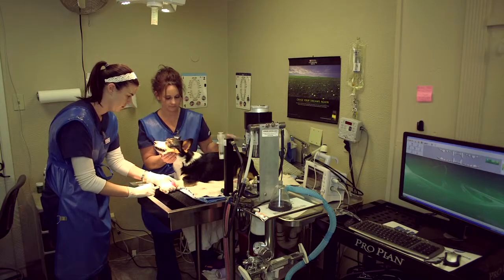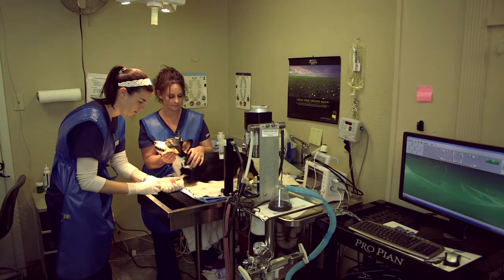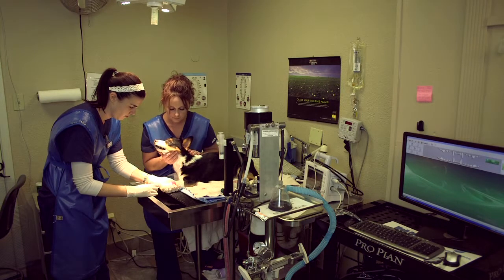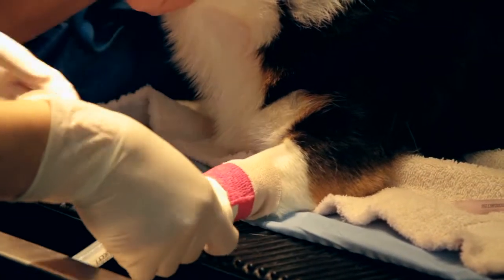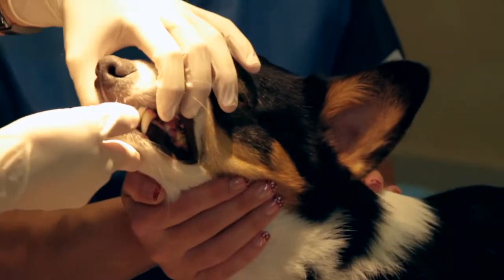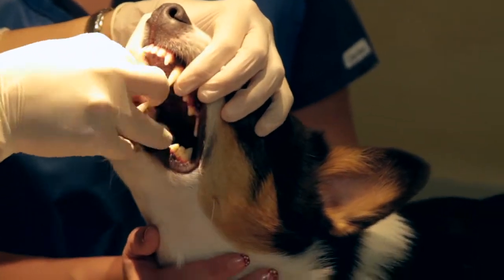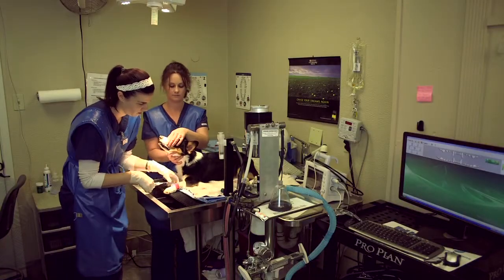So she's going to give a little bit more medicine. And keep in mind too, SNAP was given a pre-anesthetic medication, a cocktail if you will, of meds to reduce anxiety and to sedate SNAP a little. This is called balanced anesthesia, and balanced anesthesia is anesthesia that is using many drugs at very, very small doses, and it makes it very much safer.